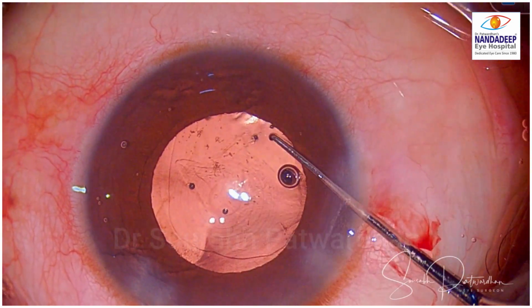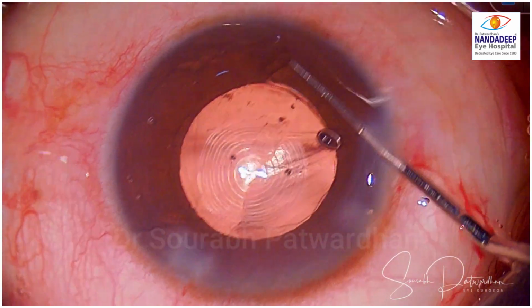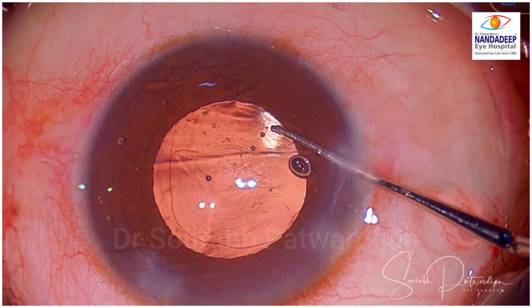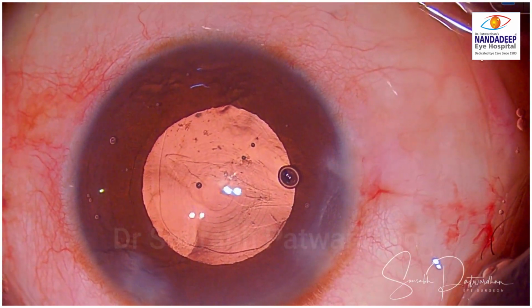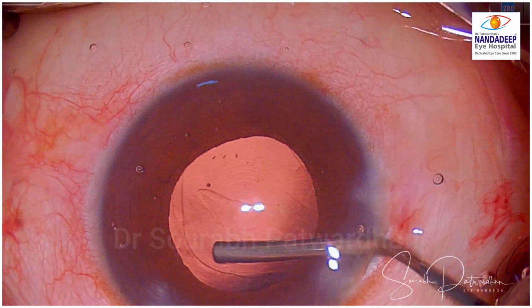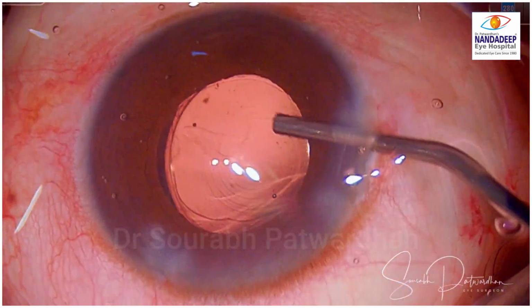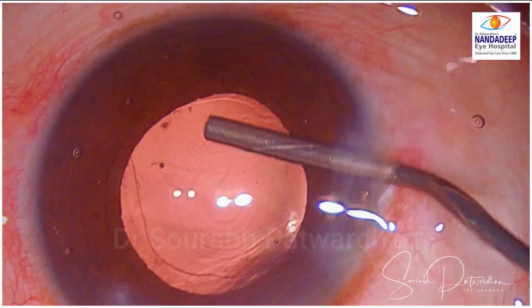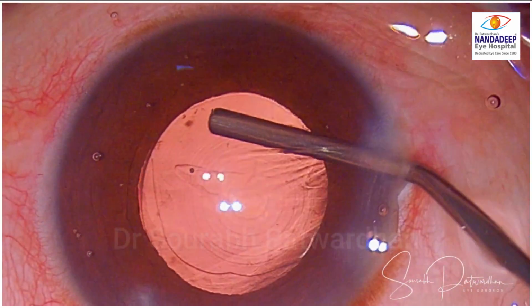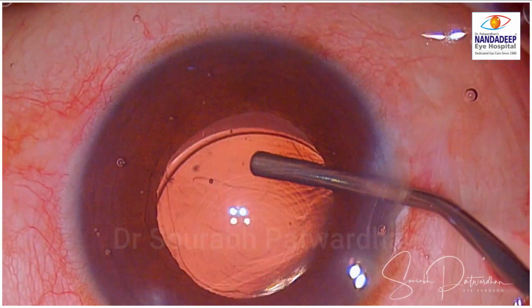I think a good instrument to have in such cases is a Y pusher, because you can properly check for the CCC margin. So I realize that now the haptics are not in the bag on this side. So I'm trying to push them into the bag there using the visco cannula.